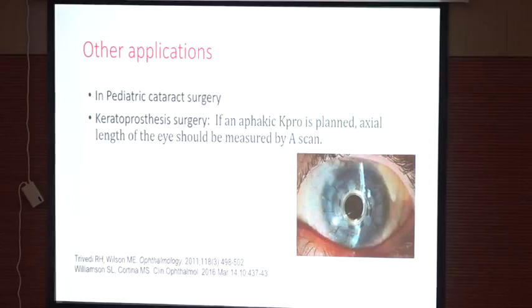There are other applications of A scan as well. It's used in pediatric cataract surgery and in keratoprosthesis surgery. If an aphakic K-pro is being planned, the axial length of the eye is measured by an A scan.